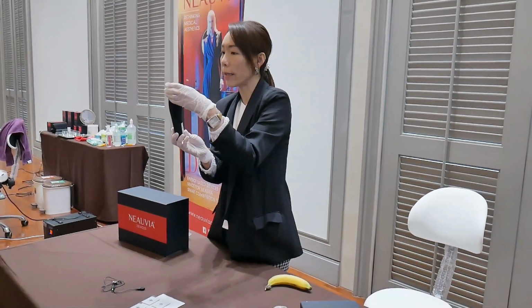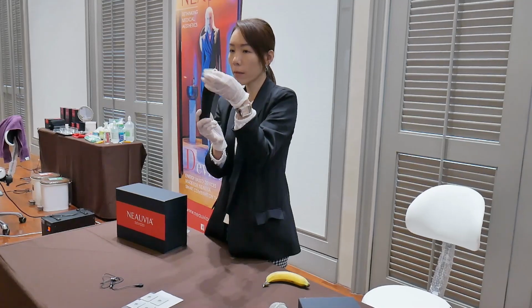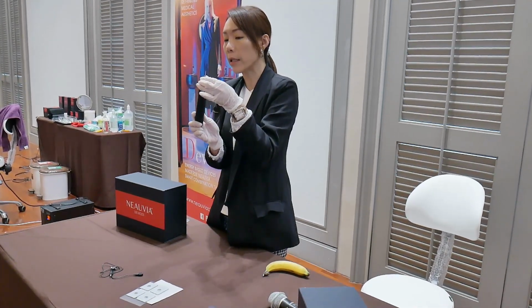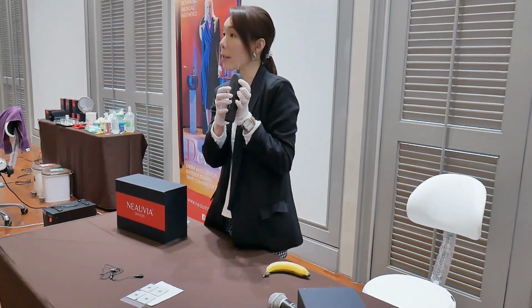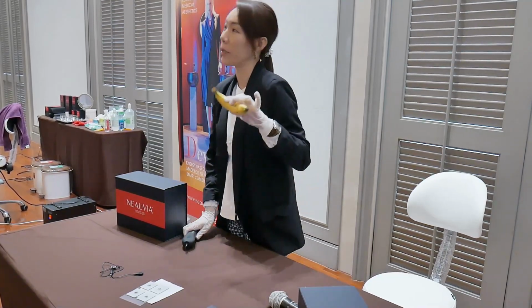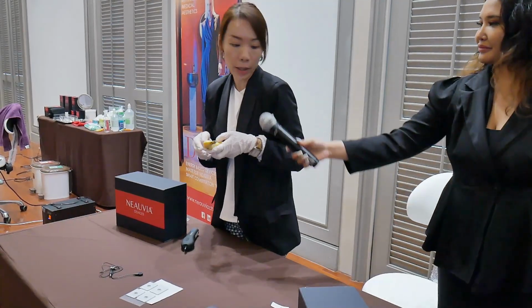I've just tested it and now I'm going to lock it back. Tighten it and make sure that the needle is really locked tight. Okay, and earlier this morning, Alex showed that there is a low mode and a high mode. So today's patient is a banana. And we know that Plasma IQ is indicated for wrinkles.